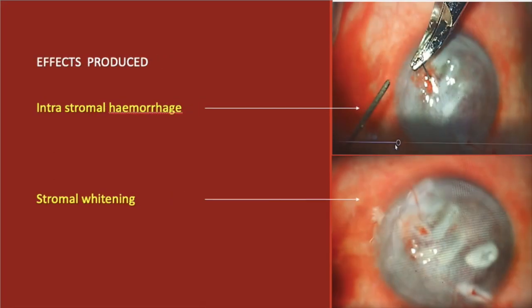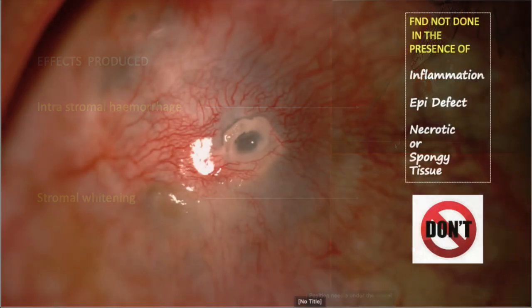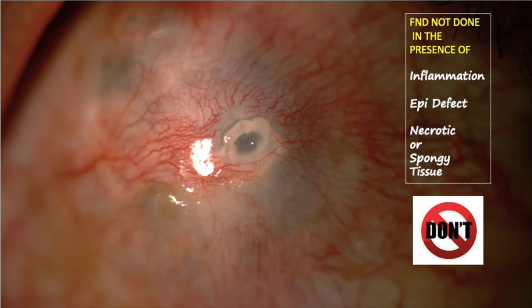Intrastromal hemorrhage and stromal whitening are side effects encountered which show that the treatment is working and the recovery post-procedure is good. When should we avoid FND? In the presence of inflammation, necrotic and spongy tissue, where the blood vessel needs to be present for the healing process. Sudden occlusion of the vessel in these situations will result in necrosis or melt of the dependent tissue.